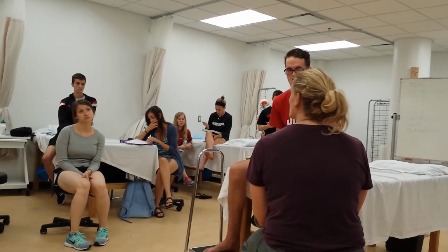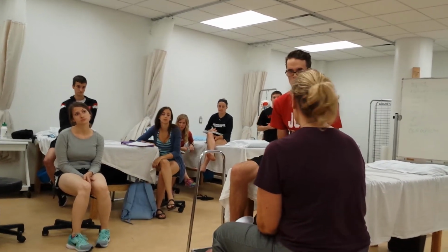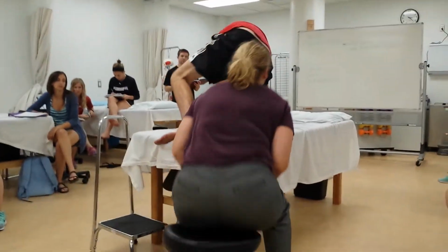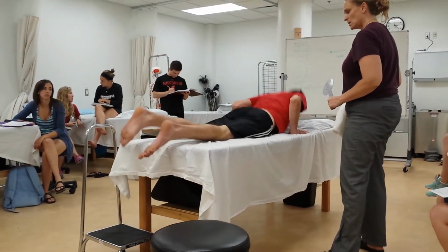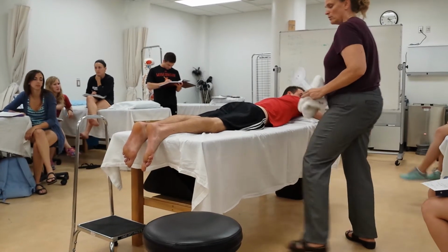The last goniometric measurement is extension. It's going to be the exact same thing, same landmarks as we used for flexion. Go ahead and lie down on your stomach. Put your head down there, feet hanging off the edge, please. Do you want anything to be more comfortable? I'm fine. You're good, okay.